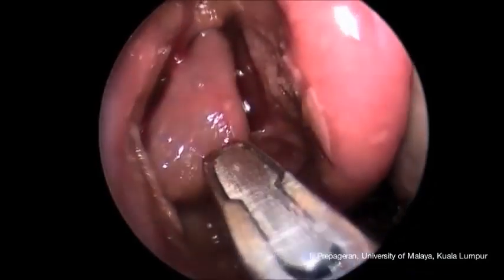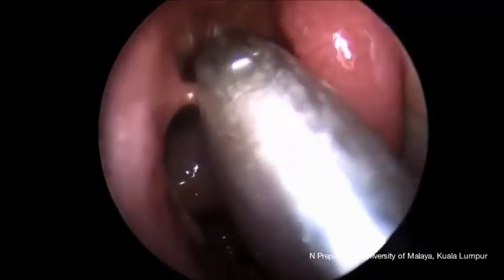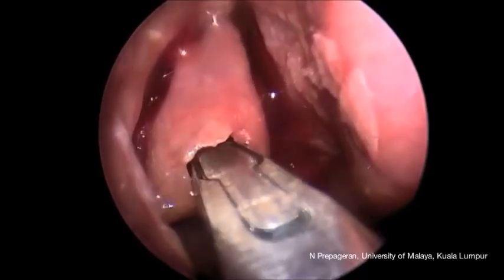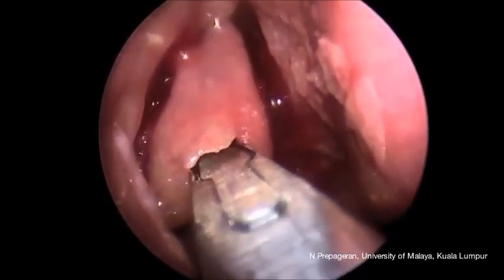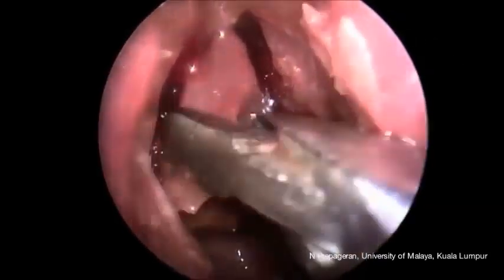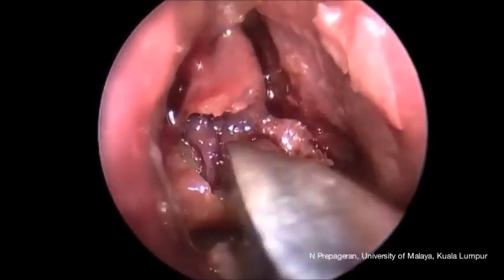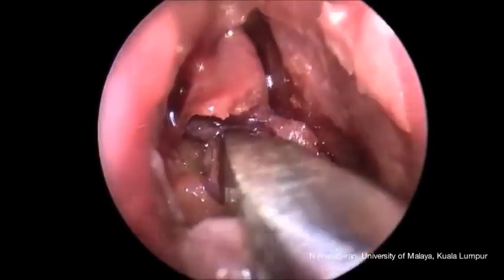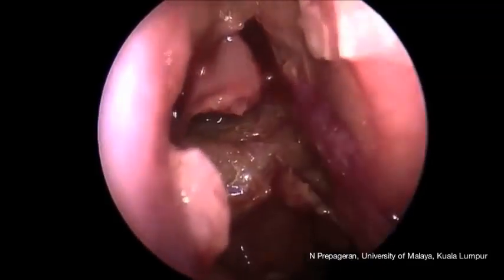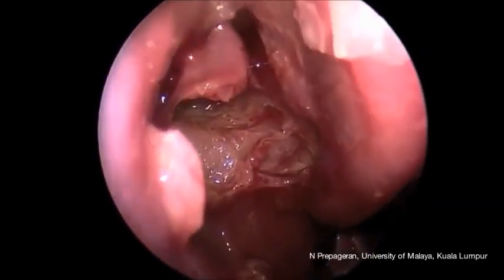Again, the first thing we need to do before we do an ethmoidectomy is to make sure there's an air cell. So the air cells are always our friend, and by using an instrument, we can actually puncture the belly of the bulla ethmoidalis itself, making sure there's an air cell. Once we know there's an air cell, then we can use any instruments you like, whether it's a powered debrider or just a forceps like what I'm doing right now, to remove and open up all these cells in the anterior ethmoid or bulla ethmoidalis, and you can actually visualize here the ground lamella, which is gate number 3.